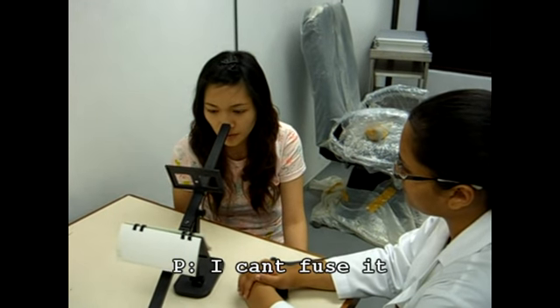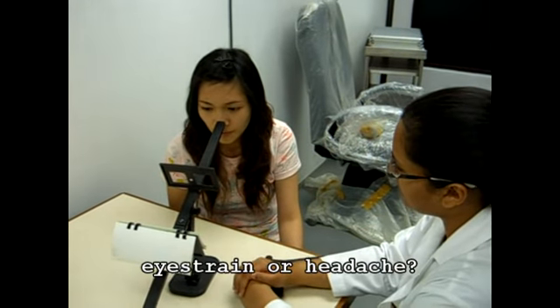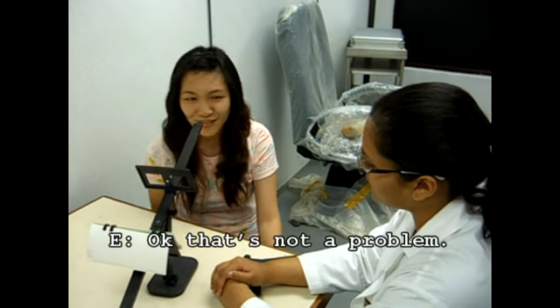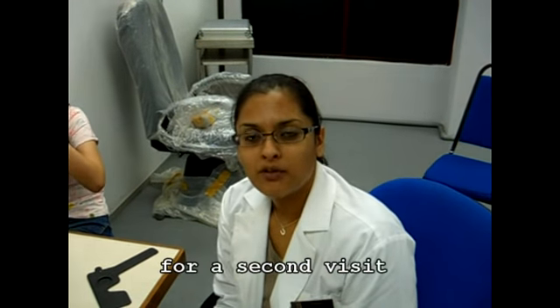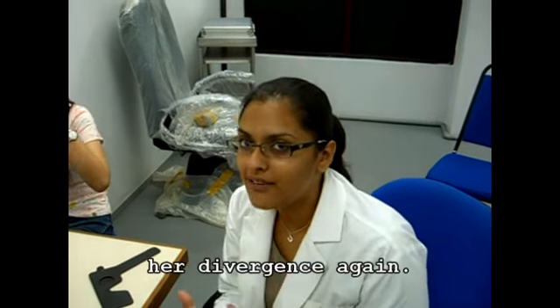I can't fuse. You can't fuse it. Are you feeling kind of eye strain or headache? Yes. Okay, can't fuse it, that's not a problem. So what I'm going to do is, for the next visit, I'm going to ask her to come again for a second visit in order to train her divergence again. So I'm going to monitor the time that she takes to make the 2 images into one using the double aperture.